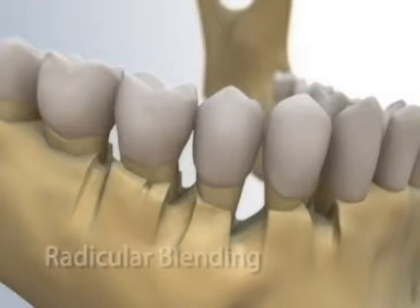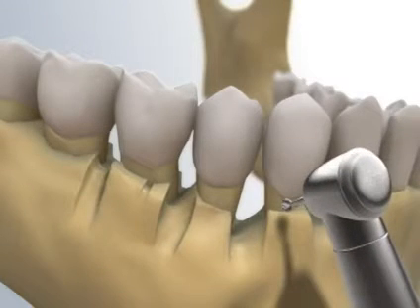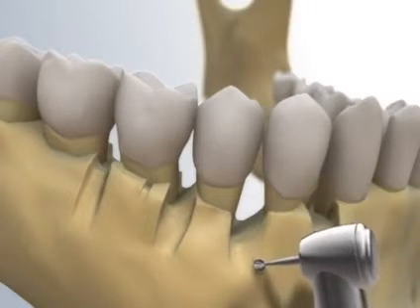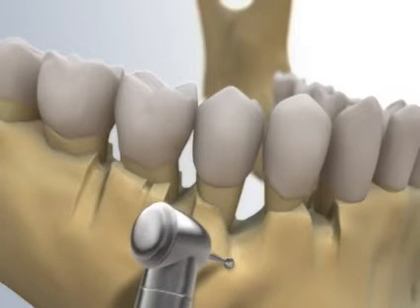The second step is radicular blending. With a long-shanked carbide burr, or number 4 or 6 diamond high-speed surgical burr under sterile saline irrigation, blend the vertical grooves with the radicular bone over teeth 4-4 and 4-5. In other words, the radicular bone is reduced and reshaped to provide a more gradual and flowing osseous topography. The final contours should resemble the festooning as seen in dentures, where there is more relative prominence over the roots.